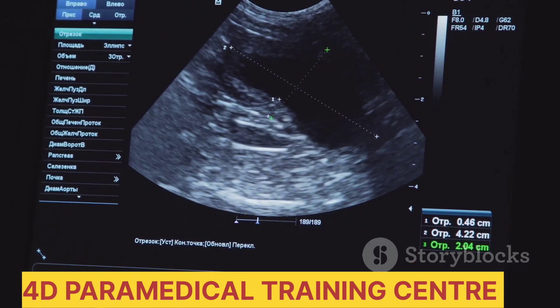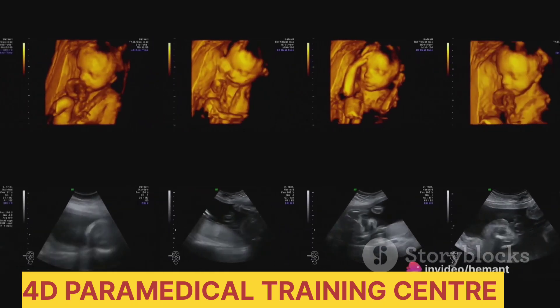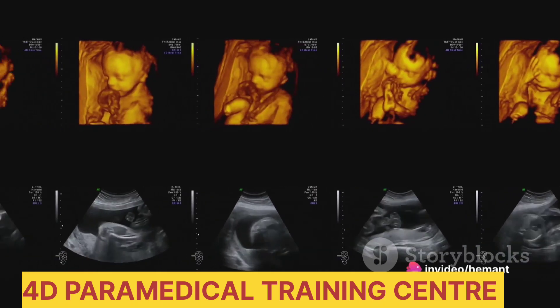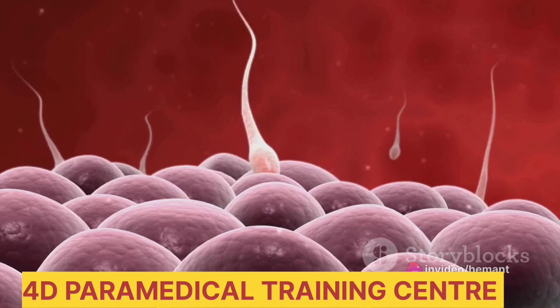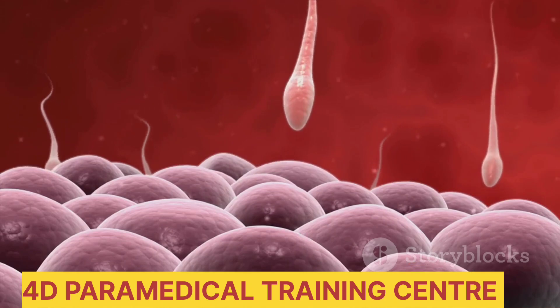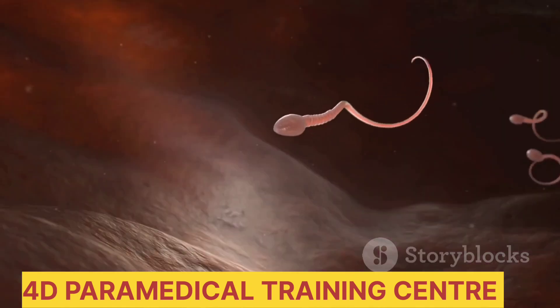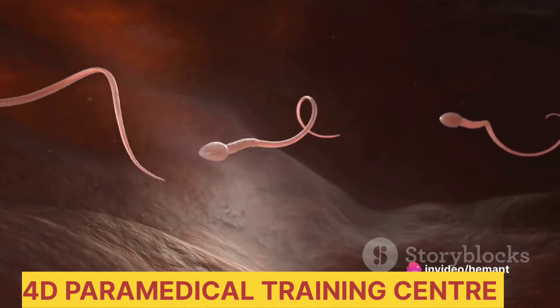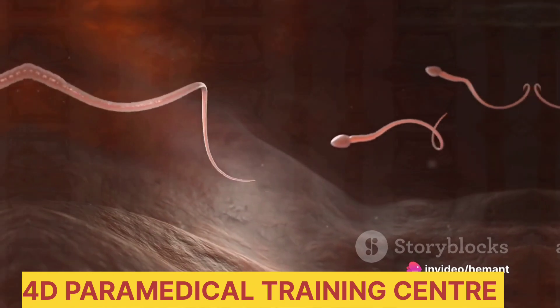Spill of contrast is a significant point of discussion. Contrast is a special dye used in medical imaging to highlight structures or fluids within the body. When this contrast spills on both sides of the fallopian tubes, it's an indication that the tubes are patent, meaning open and unblocked. This is a positive sign, as patent tubes allow the passage of eggs from the ovaries to the uterus, a vital process for conception.